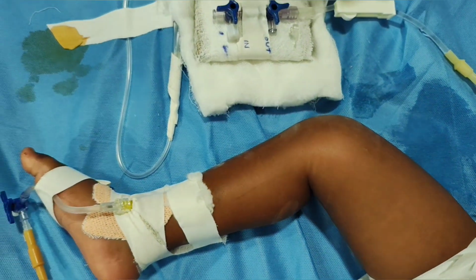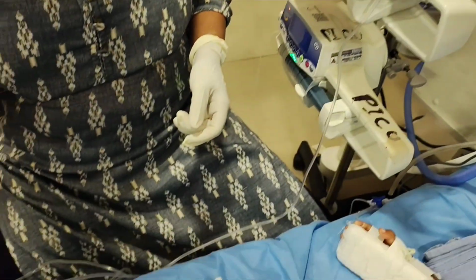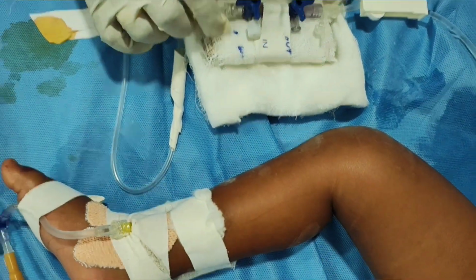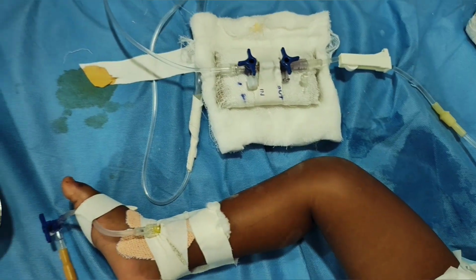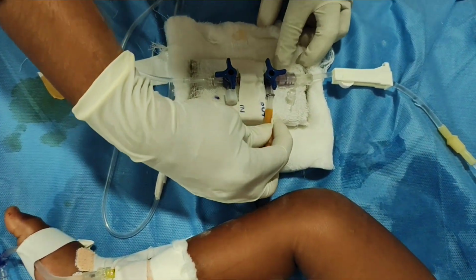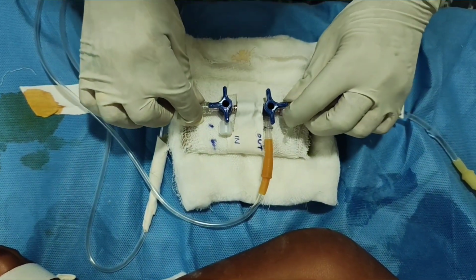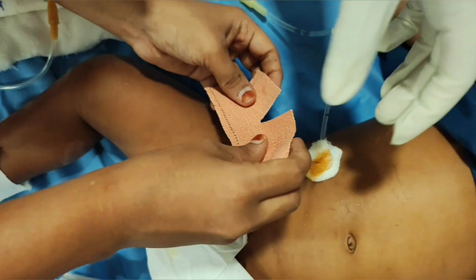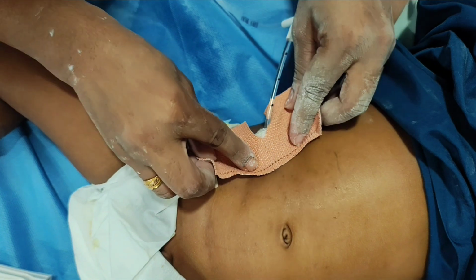Now connect this PD catheter to the three-way cannula in series. Now clean the surgical site and apply proper dressings.